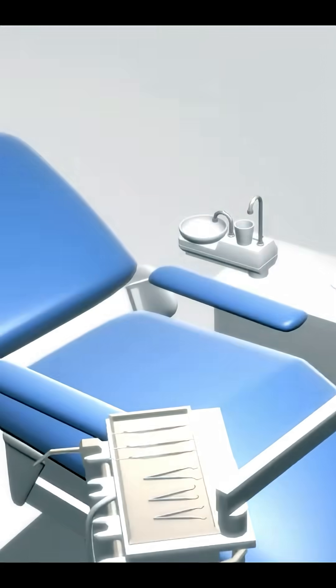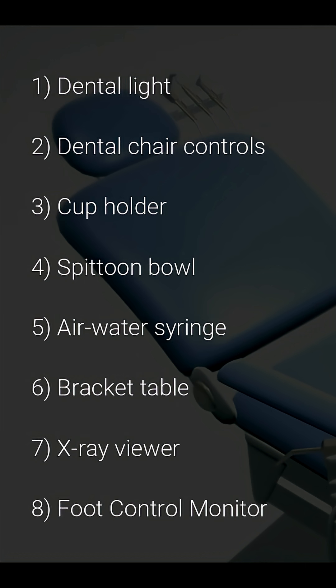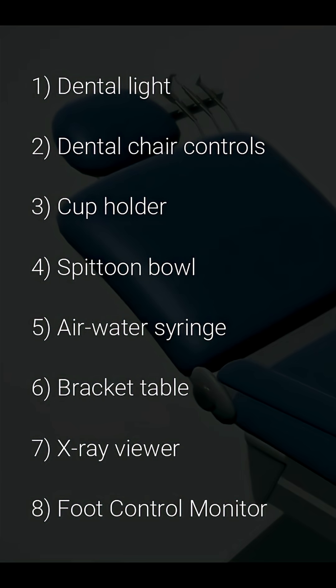We will be discussing eight of these components, namely dental light, dental chair controls, cup holder, spittoon bowl, air water syringe, bracket table, and x-ray viewer.